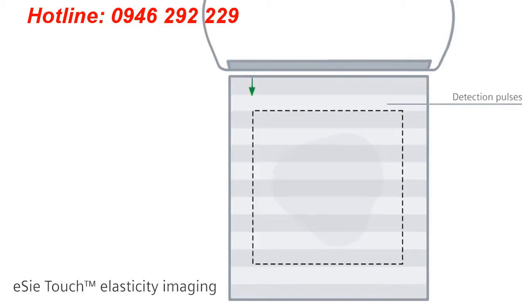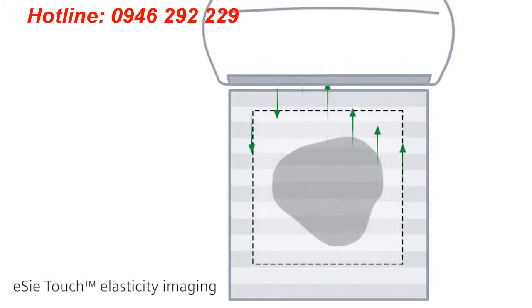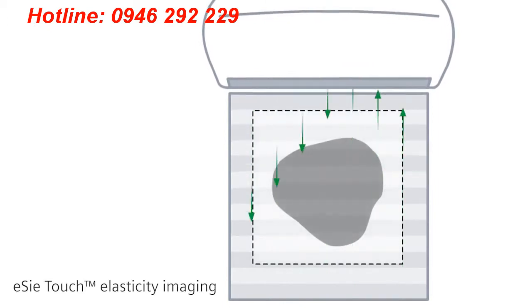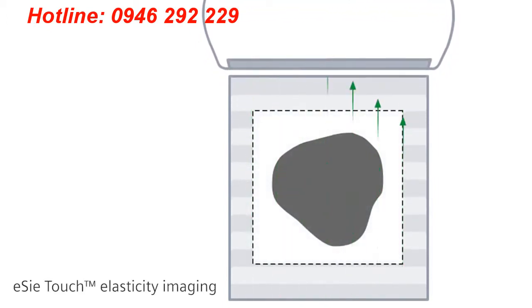We are examining an average of 20,000 patients per year, many of whom have elastography performed. Generally, we are differentiating three different kinds of elastography. The first being the standard compression elastography, where you manually compress the tissue using a transducer. The stiffness of the tissue is being coded in different colors or in black and white.